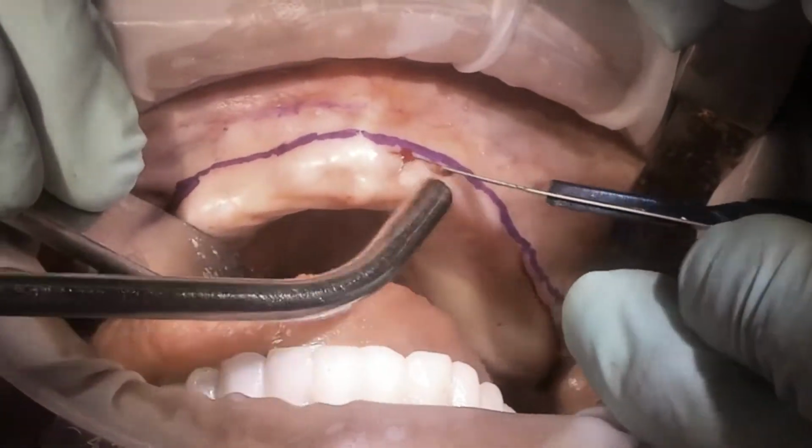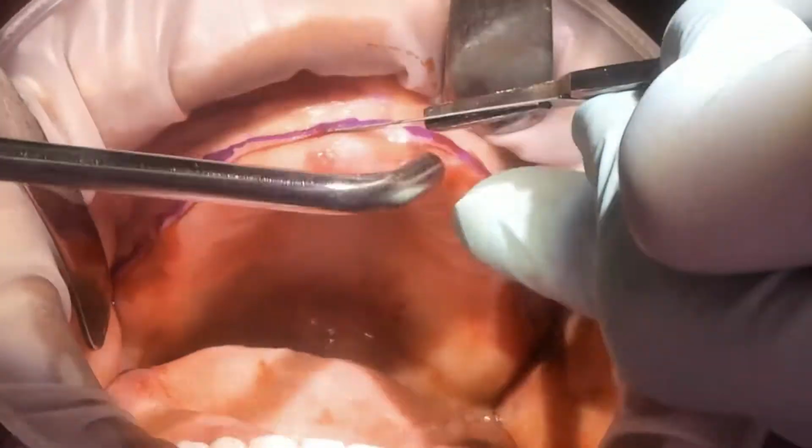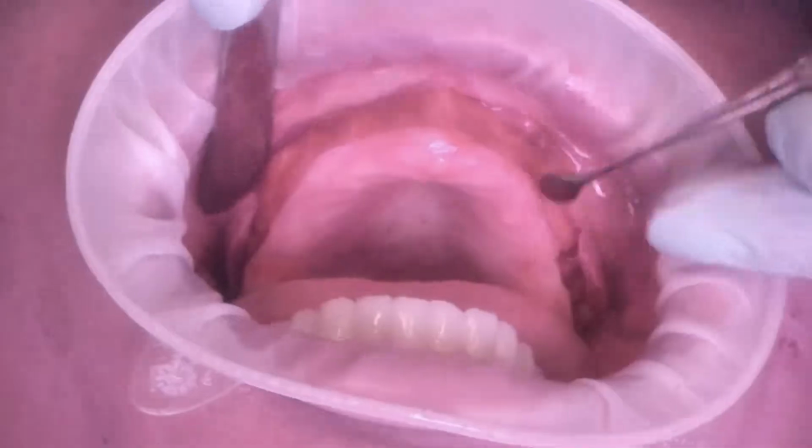A scalpel is used to lay the flap. It's important to note that Dr. Isaac Towell, who is performing this surgery, did not drill the labial sites first. This is a technique that is sometimes chosen, in which the flap is created, and then the pin guide is inserted, and then the sites are drilled.